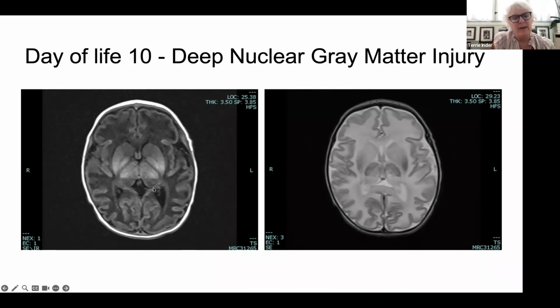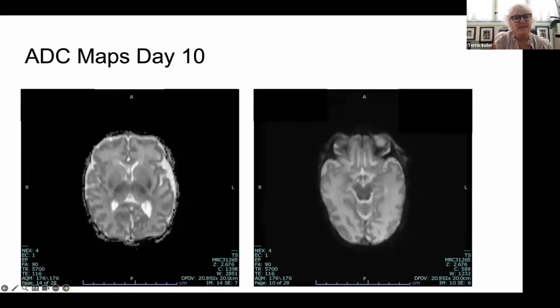And what you'll see on these babies is often they're profoundly hypotonic, and that then they emerge with early increase in tone. And you can see here, this is the diffusion. So this is out at day 10 now, and this baby obviously received hypothermia. You can see there's still some restrictions seen even out here at day 10. But importantly, you can see that this is now going down through the brainstem. In other words, this is a degeneration that's going right down through the brainstem, and very prognostically powerful for severe cerebral palsy.